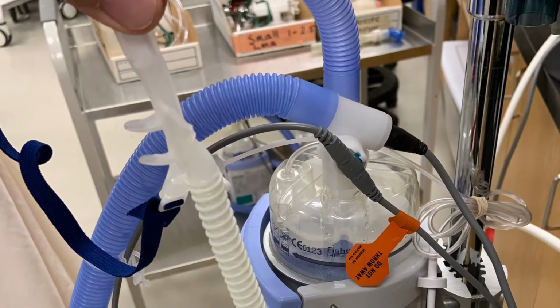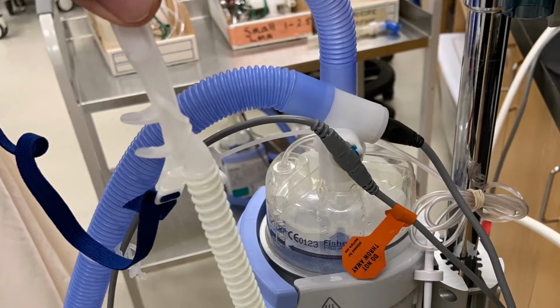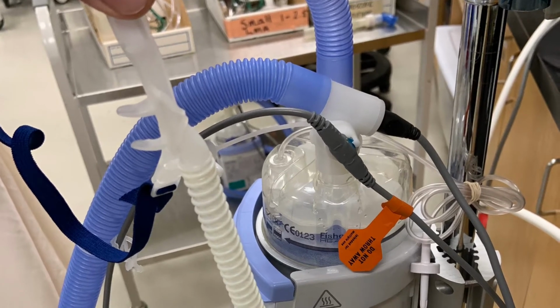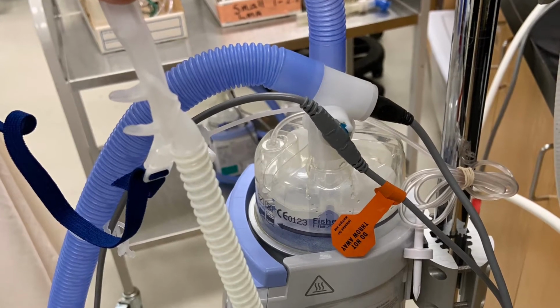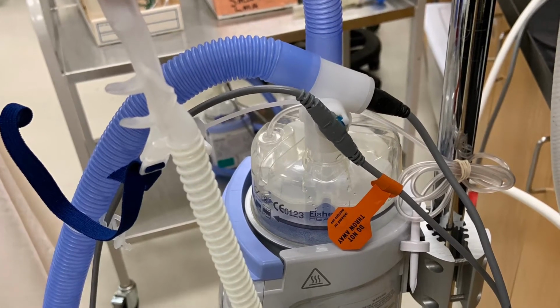Here I'm holding the nasal cannula. The prongs on the nasal cannula can be no larger than half of the internal diameter of the patient's nares. This allows excess gas to flow from the nares and not build up pressure in the patient.